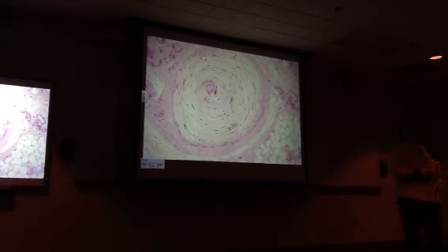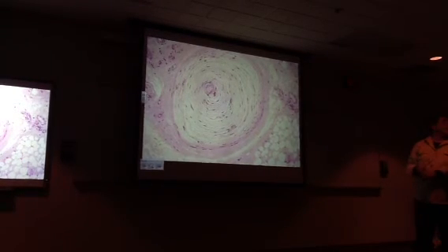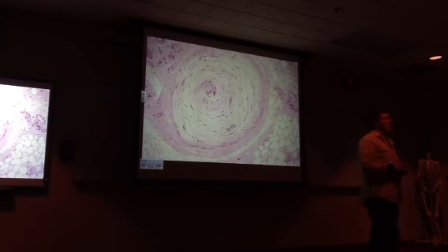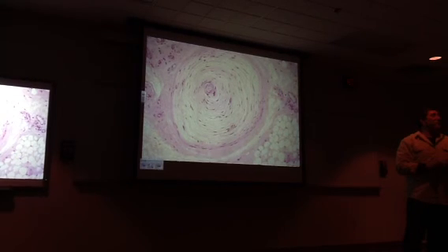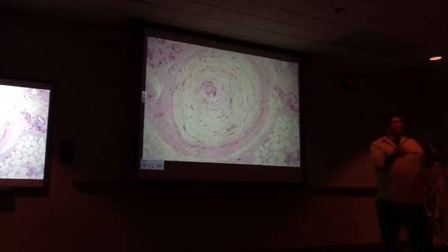The circular rings around all those cells right there, are those supporting cells? What are those? They're fibroblasts, probably, and they're just making these concentric rings, and these concentric rings of tissue in real life are just filled with fluid. Okay, so it's like a mechanoreceptor. When you're pressing, it's firing, and it's just sensing pressure.